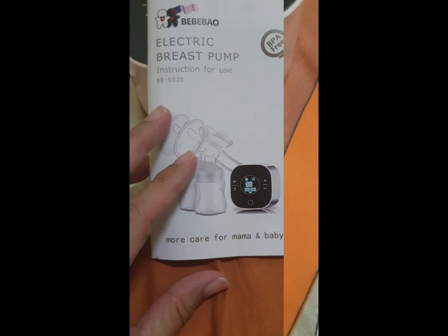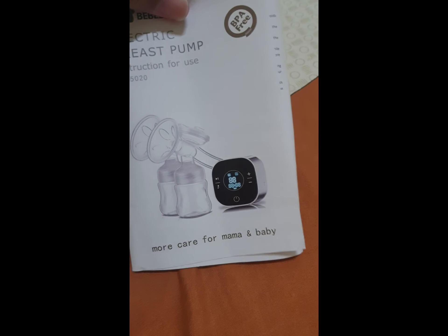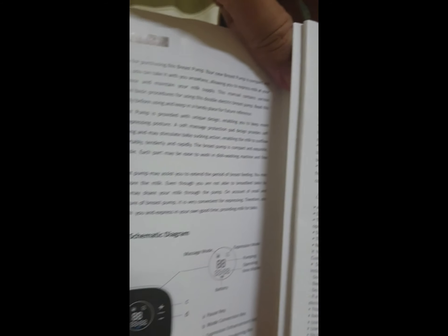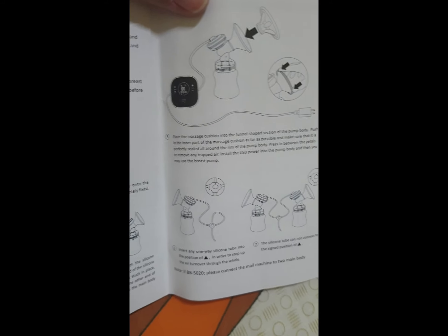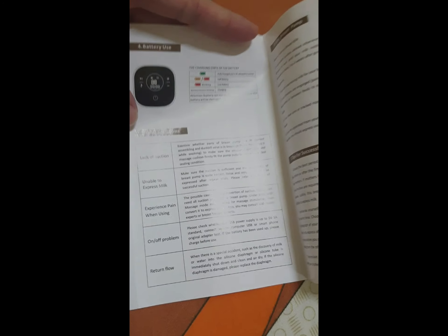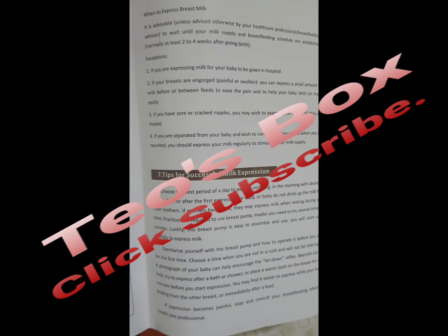The bionic mode manual is in English. It has introduction parts, how to prepare and assemble, facts about the pump, and battery use. Use the breast pump tips provided.